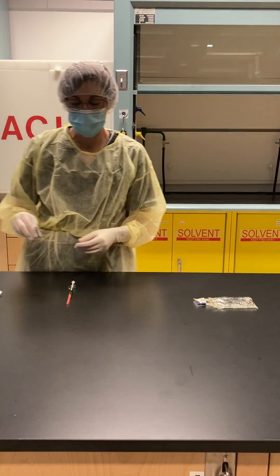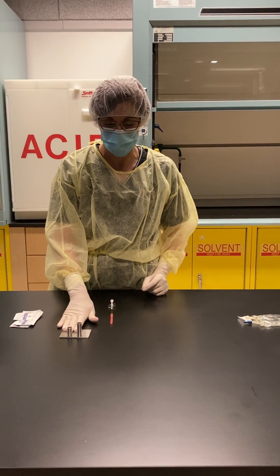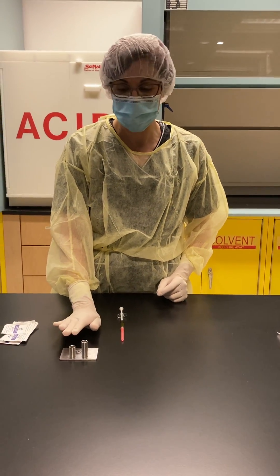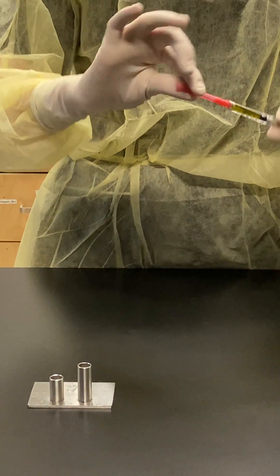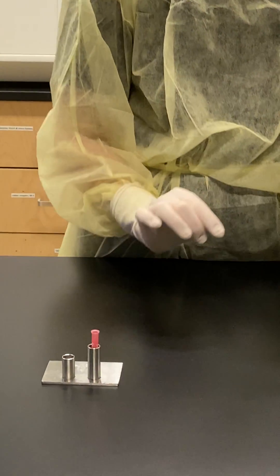This time, instead of using an alcohol swab, I'm going to use a needle cap holder. These are really handy because they reduce the risk of a needle stick injury. How that works is you just take your needle cap off and you place it into the slot.